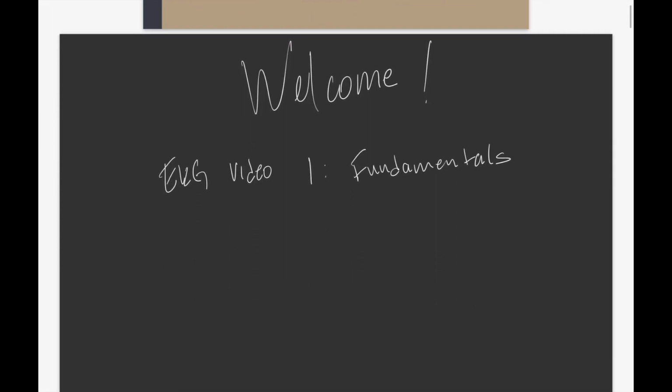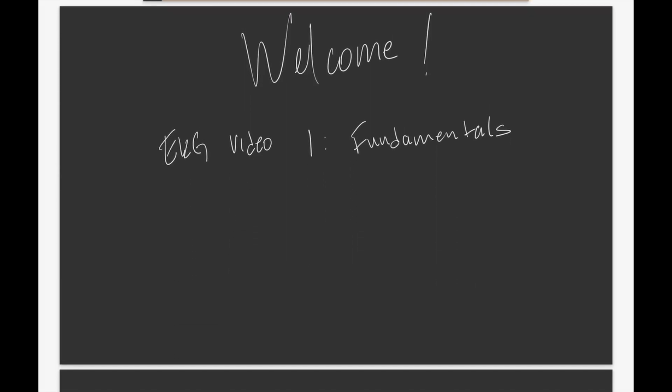Now, before we begin, a quick intro. We should talk about what this video is. This video is an introduction into pattern recognition for interpreting 12 lead. Okay?